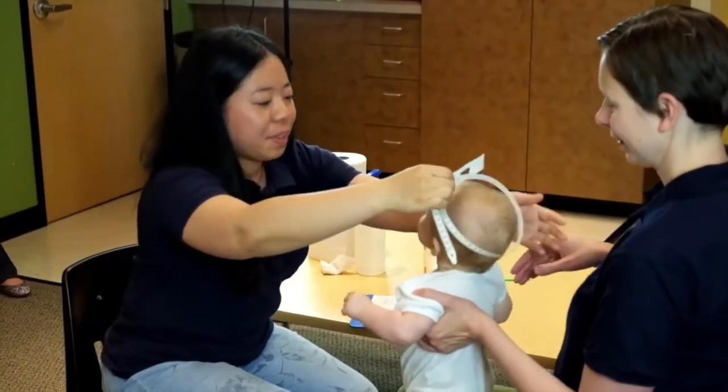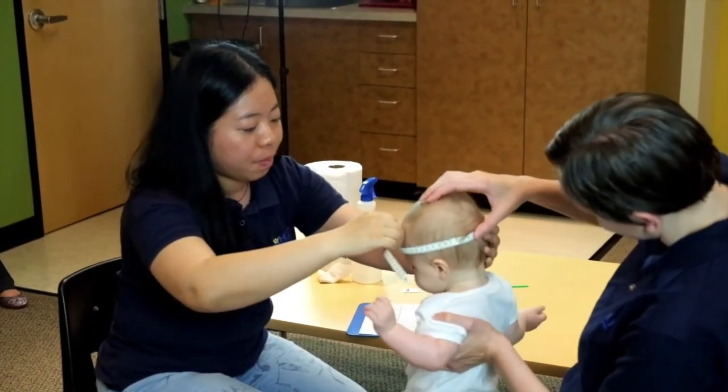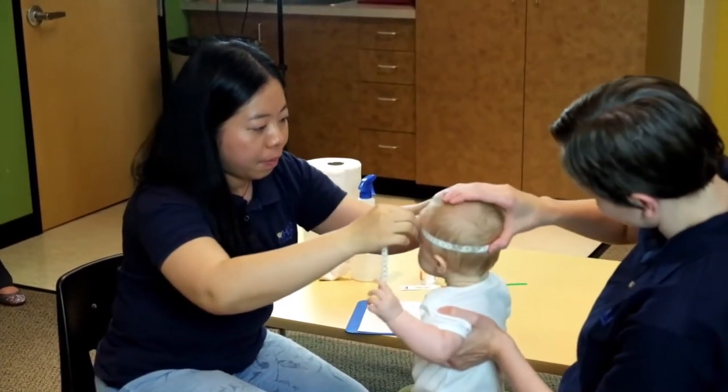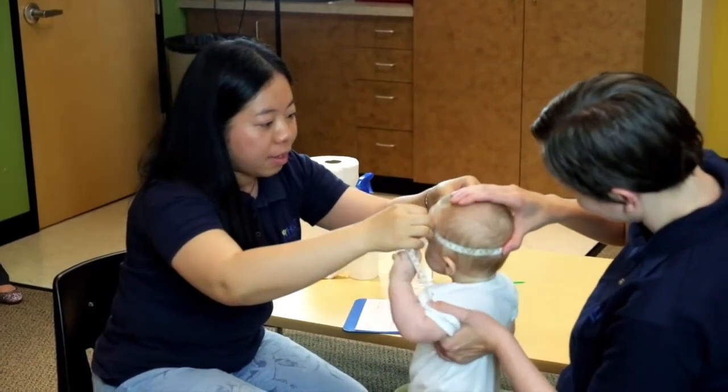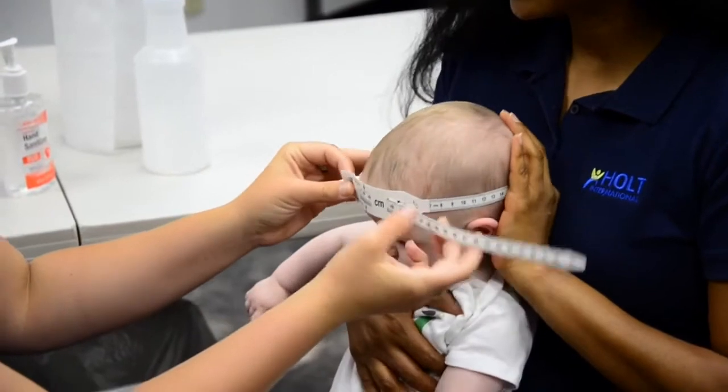Pull the head circumference tape firmly around the child's head so that the hair is compressed and there is not space between the tape and the child's head. However, be sure not to pull the tape so tightly that the child's skin bulges around the measurement tape.